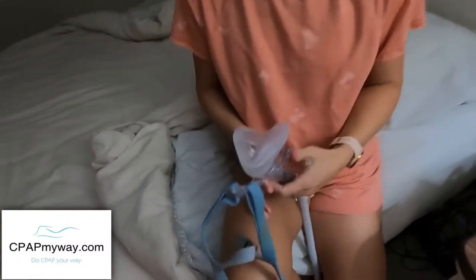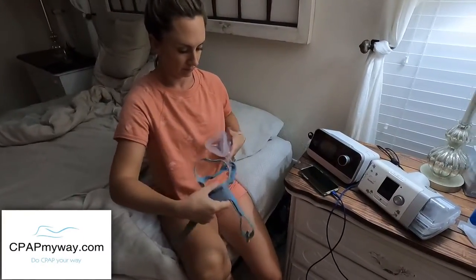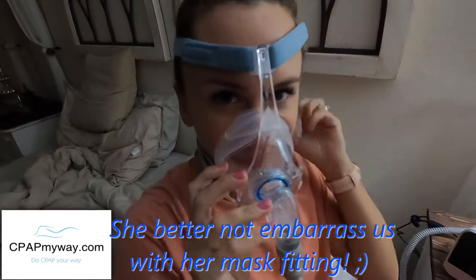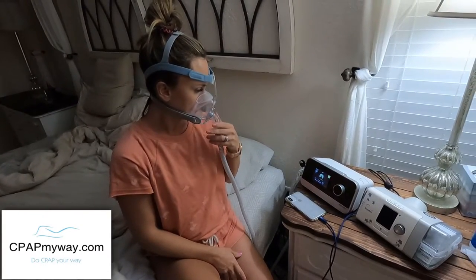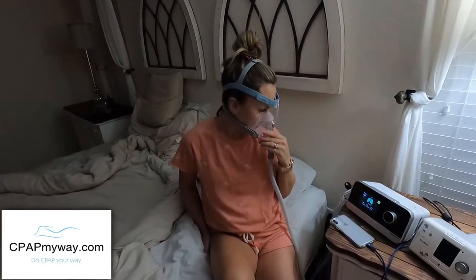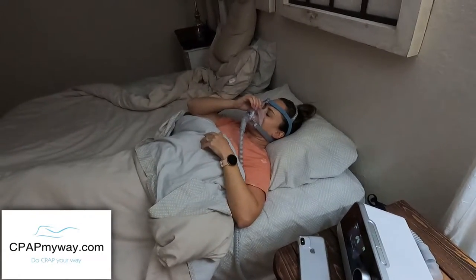Get the Viterra. What is that, a small? It is a small. In fact, no. Should have cleaned my mask. Make sure you get a good seal on that. We don't want to mess that up. Okay. That's good. Great seal. Feels all right? It's quiet. All right, she's running. Very little noise. Let's see what the night brings. Night night.